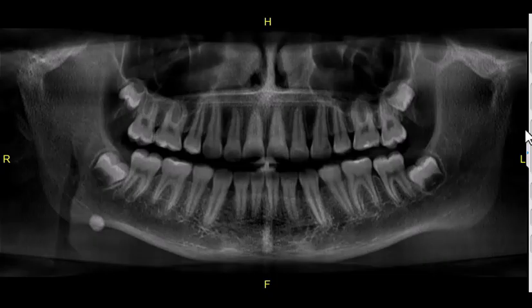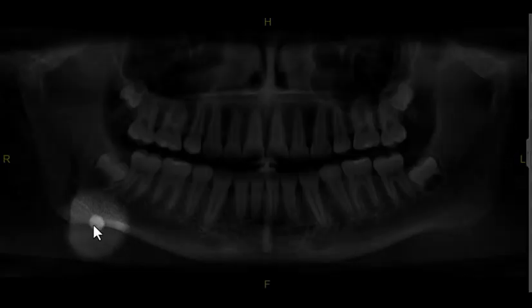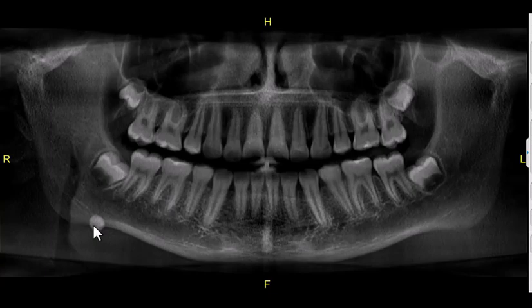Here's the panorex from the cone beam CT scan that we took in the office. You can see how the radio opacity has moved basically inferior to where it was on the original panorex that the referring office sent over. So I don't think it's in the mandible based on that information alone.